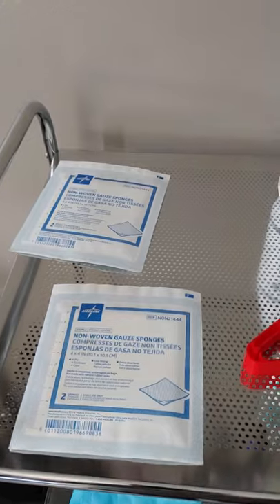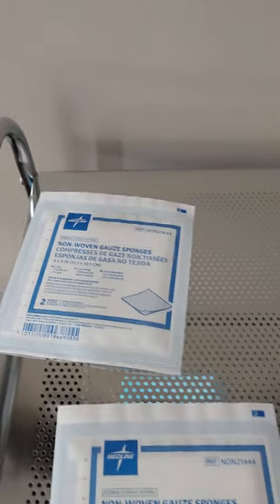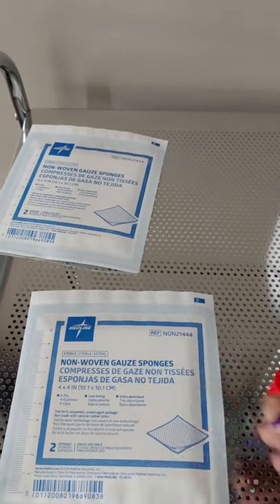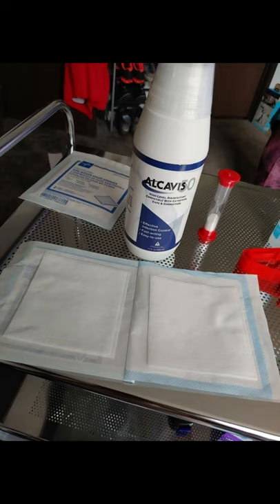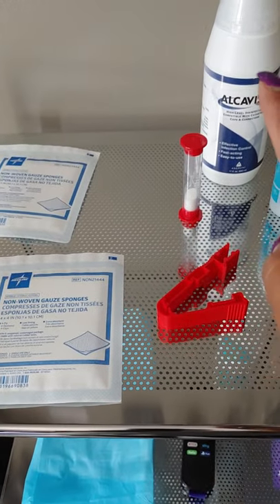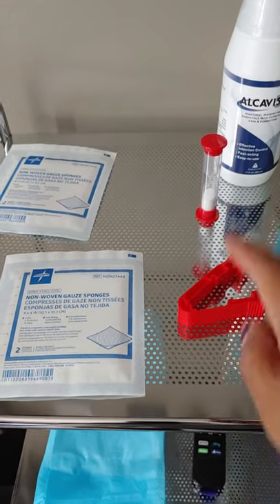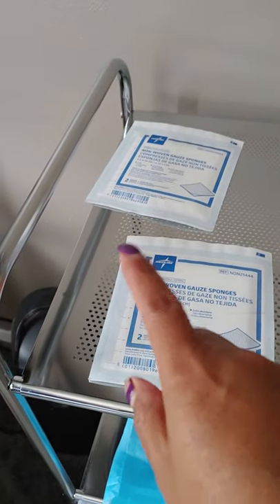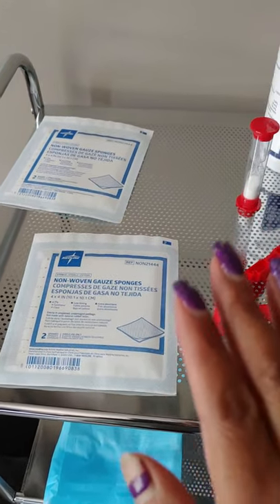You always want two sterile sponge gauze things out: this one is going to clean your catheter before you connect, and this one is going to be the one you use to clean after. Both packages have two in them, so when you peel them open you'll have one on each side. You'll dress one with the Alcavis, set your timer, and scrub it for a minute. When that's done, use the other open side to dry the catheter so it's not wet, because liquid attracts bacteria.